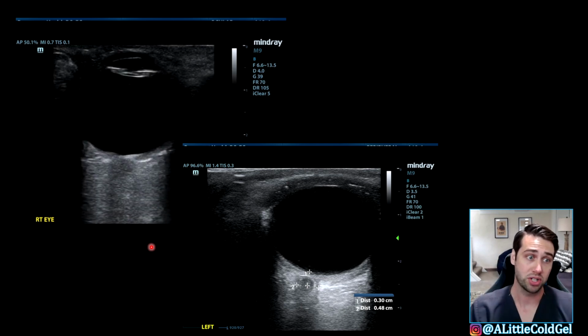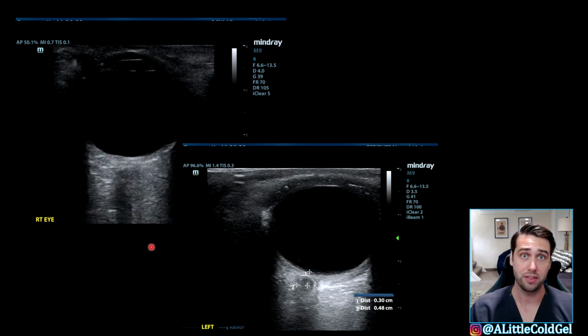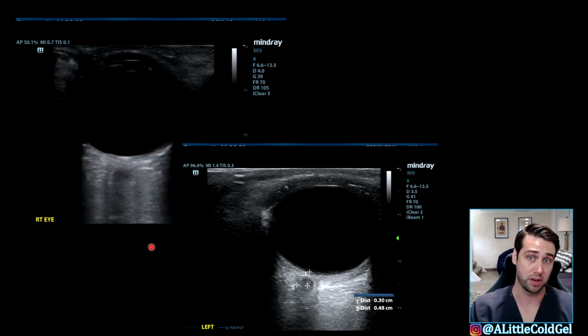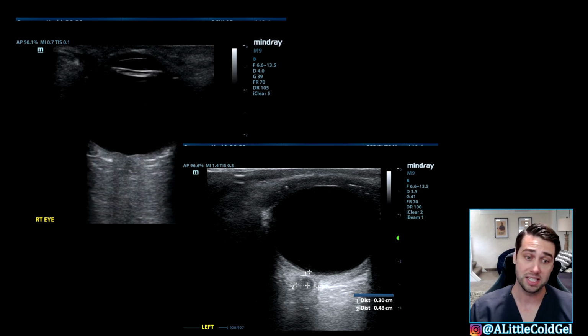And the way to accomplish this is kind of find the nerve and then have the patient look around the room to the point where you can see those two walls parallel to one another. And really that's it for ocular ultrasound.